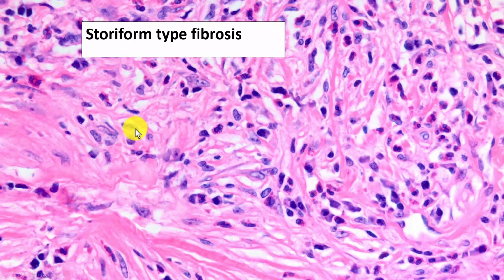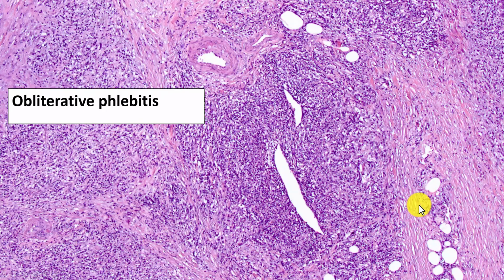These are what I often refer to as the forgotten cells of IgG4-related disease. They're fibroblasts or myofibroblasts. They'll stain with actin. The one thing I would remind you is that these cells should not be showing any atypia whatsoever. Again, the prominence of eosinophils. In fact, the eosinophils can be so prominent that you might actually consider the possibility of a parasite or something like that.